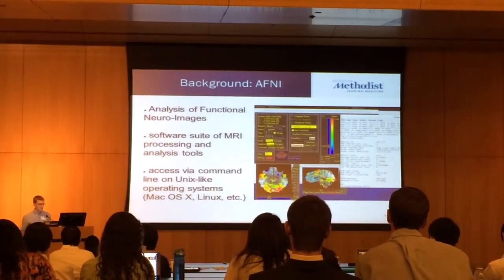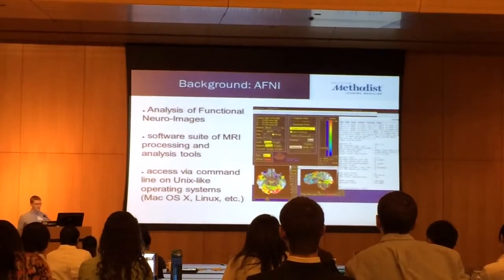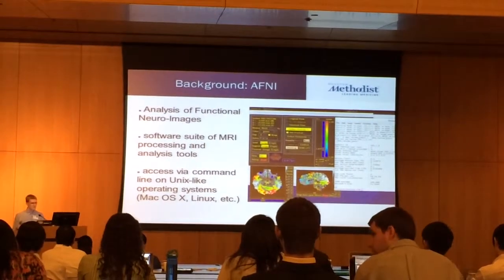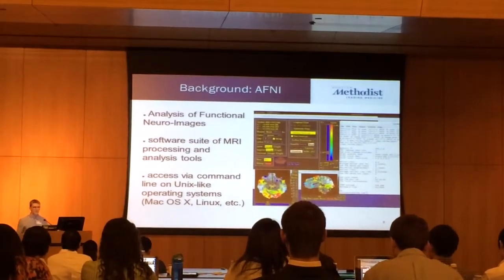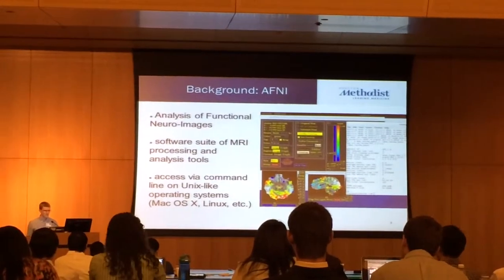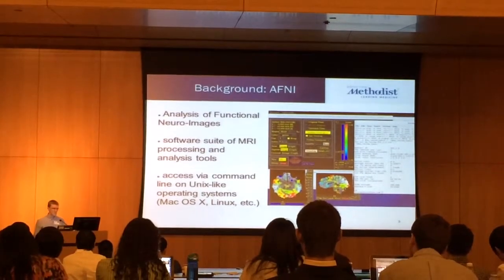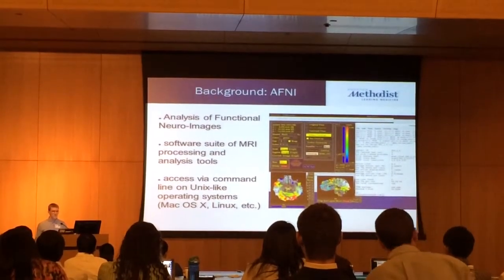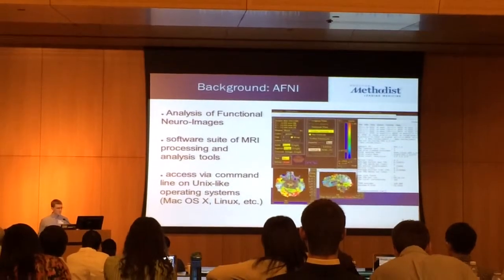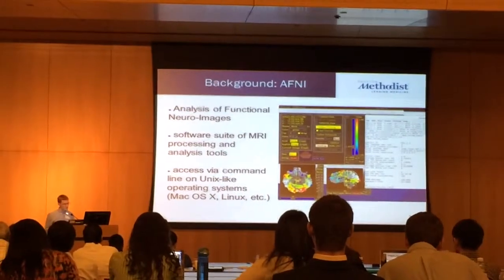AFNI is a set of software programs which are used to process and analyze MRI data, and that's the main software that we've been using this summer. There are a couple of other options, but this is one of the best known. When AFNI is used, you're interacting with the command line. If you're familiar with any computer programming, you'll know what the command line is. Instead of using a graphical user interface, most of the operations are performed at the command line. AFNI just stands for Analysis of Functional Neuroimages.